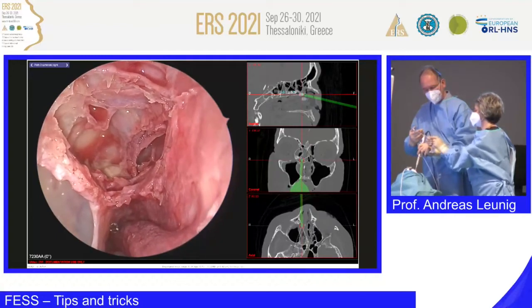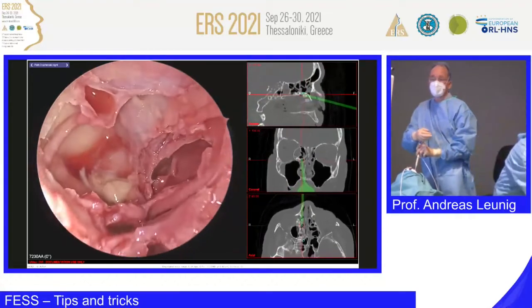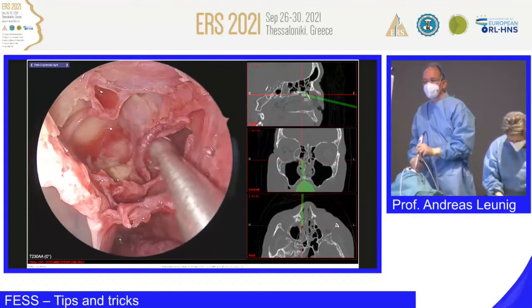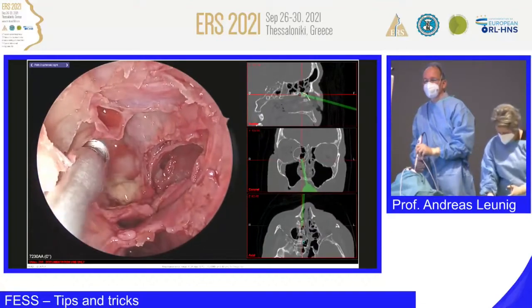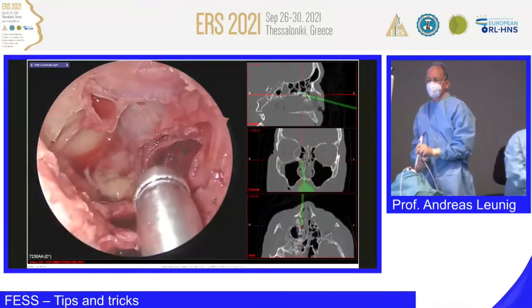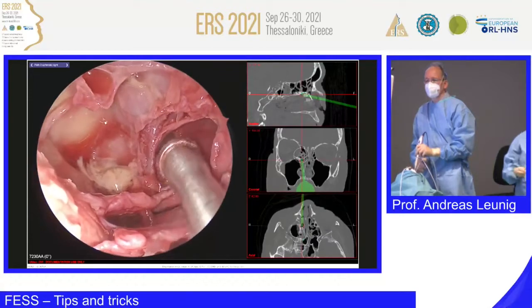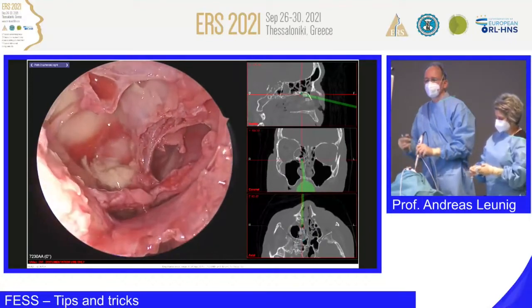Sometimes the instruments. Good? Andreas, can you point out the lamina papyracea? Can you point out the orbital wall, the lamina papyracea, to the audience? I think that's coming in nicely. Yes, that's very important. So for opening the sphenoid sinus, you should be aware of where the orbital wall is, as well as the skull base, as well as the apex of the orbit with the optic nerve. So this is a very soft and gentle opening of the sphenoid sinus. Now I'm enlarging a little bit here the natural outflow tract. Yes, of course, the damaging should be done very gently.